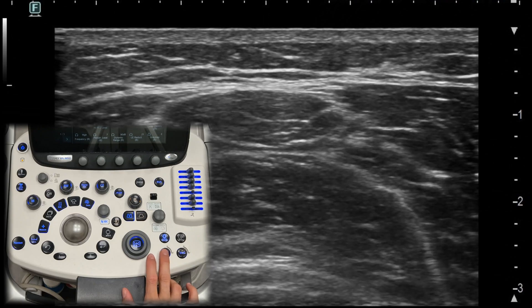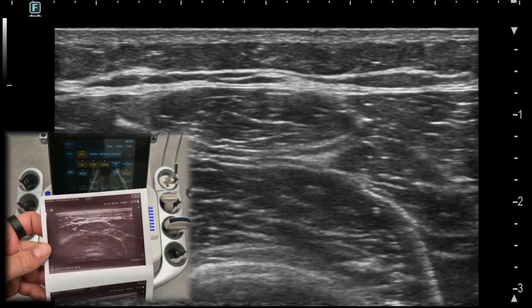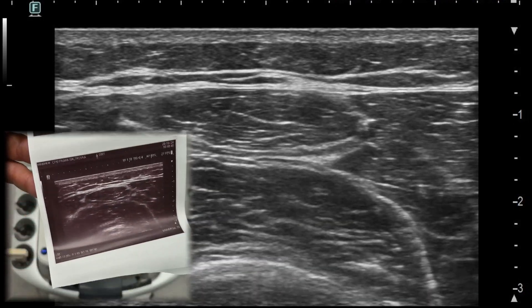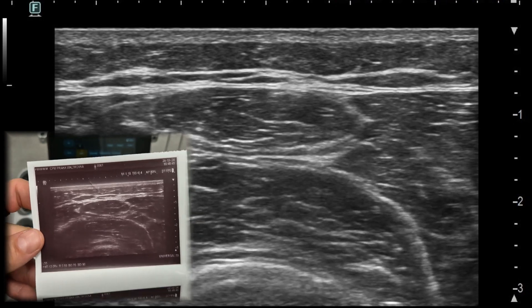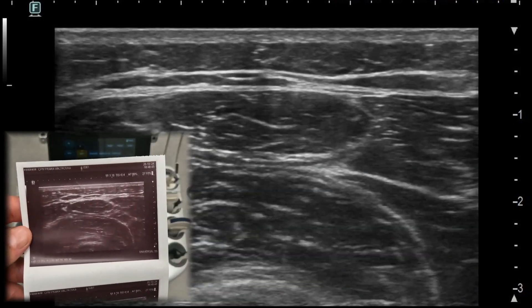Print. The print button lets you generate a hard copy of the ultrasound image. This can be useful for patient records or to have physical documentation of findings during a scan. Make sure you have the right settings before printing to capture the image you want.